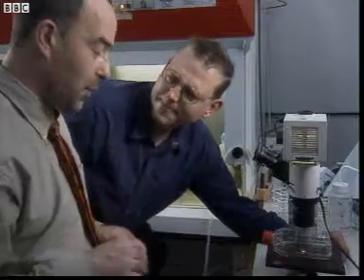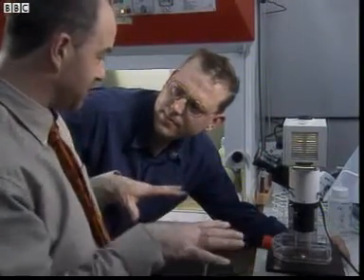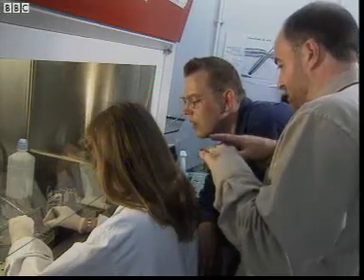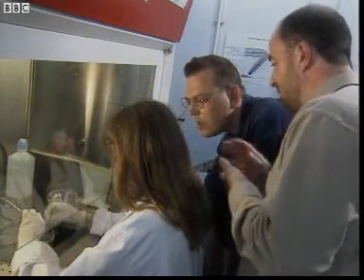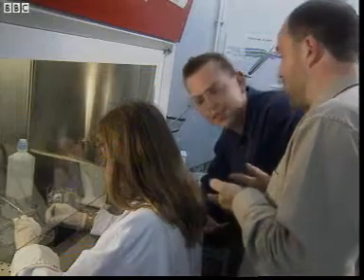So what happens next? Well, in 4 or 5 days, these cells will have grown and covered the bottom of that flask, and then we've got a sheet of skin. You can see here that it's been put onto a white dressing, and the dressing can be lifted up with the skin cells attached. And this now can be given to the surgeon in theatre, and that can be flapped onto the patient. And just stuck on? Yes. The dressing will protect the skin cells for the first few days, and then that can be removed. Leaving new skin in its place? We hope, yes.